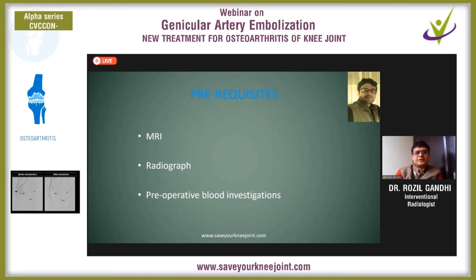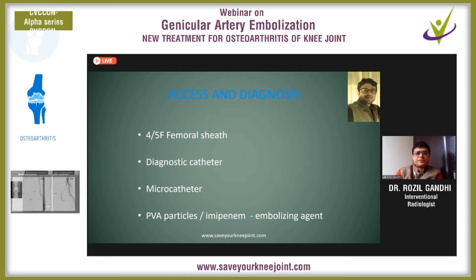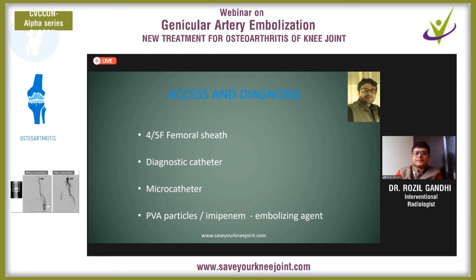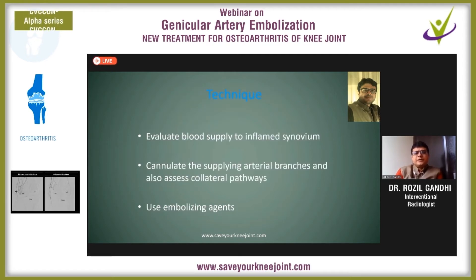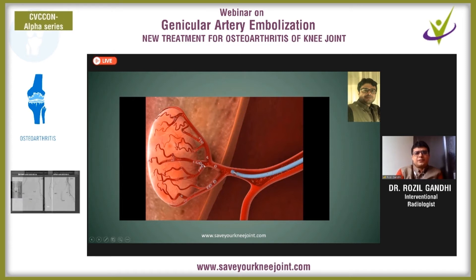Prerequisites, as already mentioned: evaluation by MRI, X-rays, and pre-op blood investigation to check for coagulation. Generally, we use an antegrade femoral puncture, insert a 4–5 French femoral sheath, advance a diagnostic catheter up to the distal femoral artery, use a microcatheter coaxially through the diagnostic catheter, and after super-selectively cannulating, inject an embolizing agent — that is imipenem. Doing an angiogram, we evaluate the blood supply of the inflamed synovium and super-selectively cannulate the branches. This is how the particulate matter goes into the capillaries — this is the neovascularity — and it embolizes it.